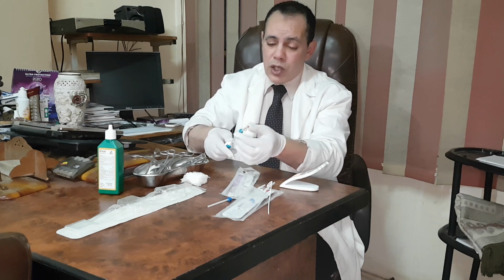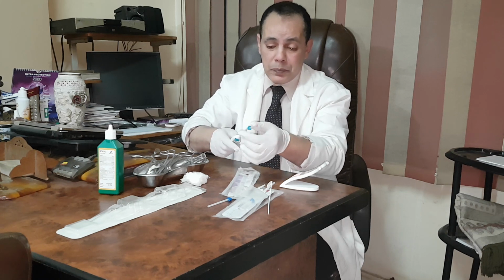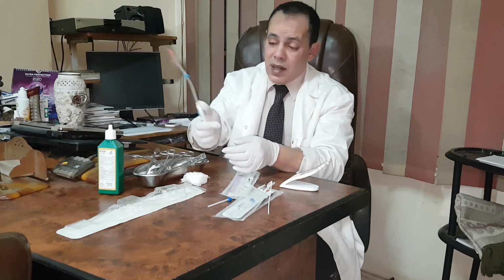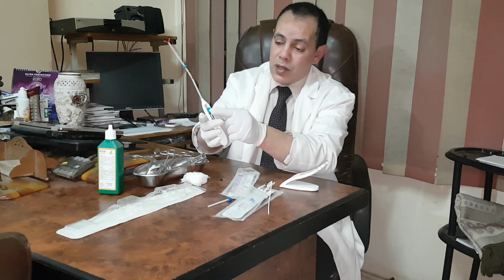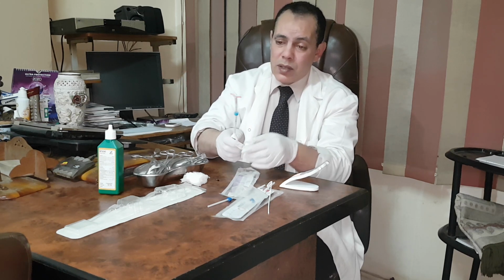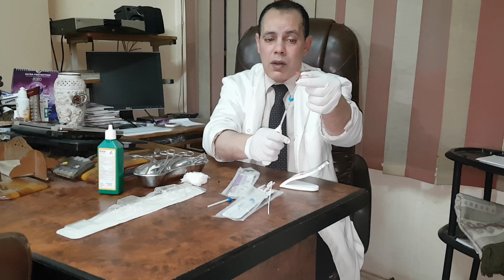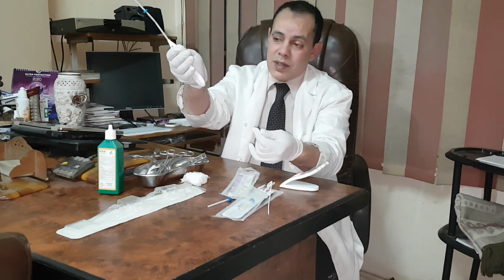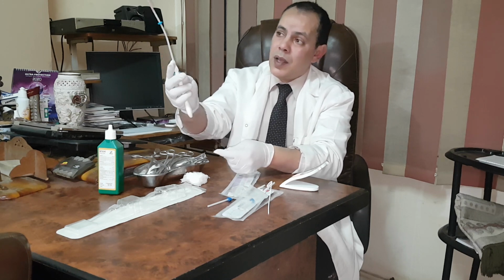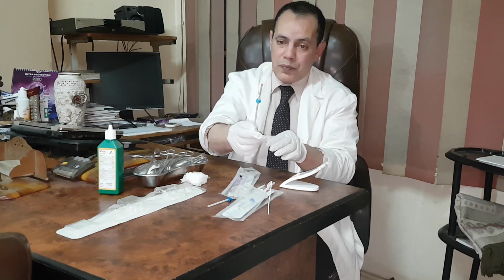So, what are the components here? This is the sheath or the tube, and this is the flange, and this is the slider. This one is called the slider, and the IUD inside. To see how it locks, this is the IUD, as you see, with two transverse arms and one vertical arm. And this is the sleeve. When you draw the sleeve like that, sorry, the IUD is ready in this situation.